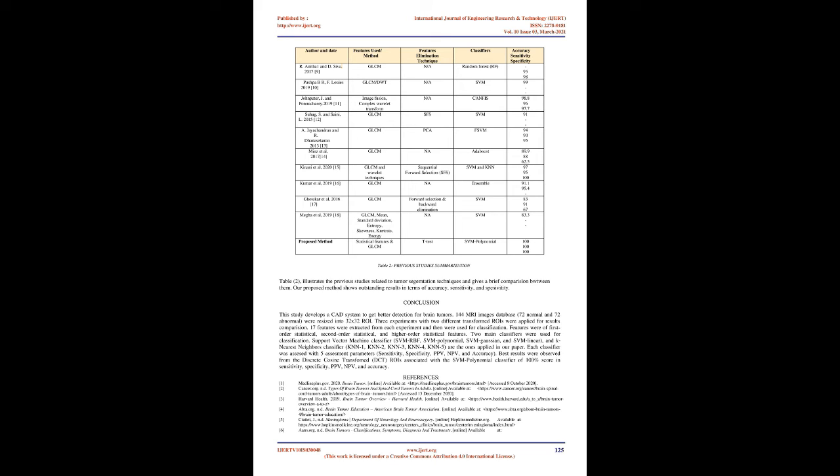Results and discussion. Results were obtained after implementing 3 trials with 2 different transformed ROIs. Features were first extracted from the original ROI, then from radon transformed ROIs, RT, and finally from discrete cosine transformed ROIs, DCT. The testing ratio for the database was almost 32% out of 144 ROIs, with 23 normal and 23 abnormal.